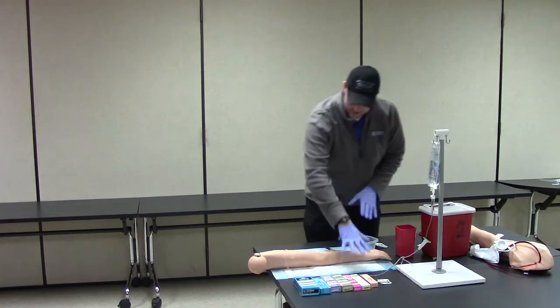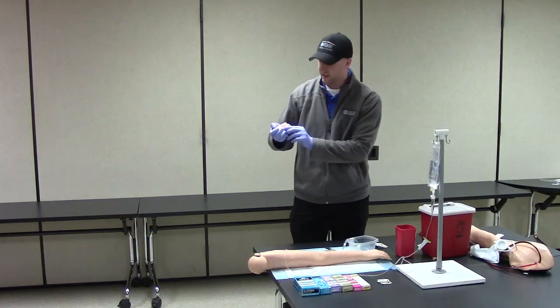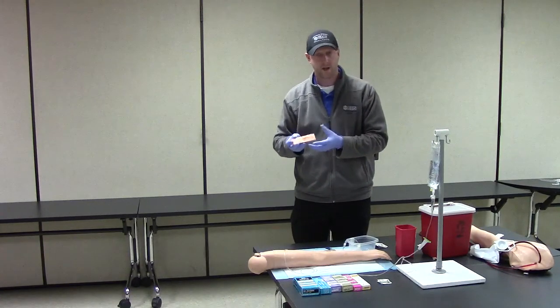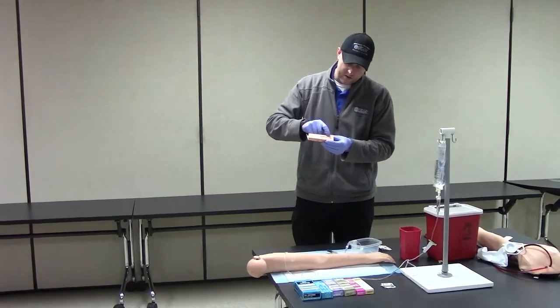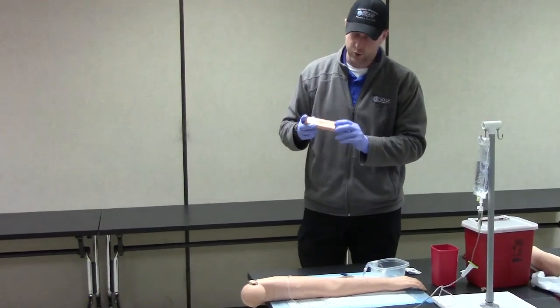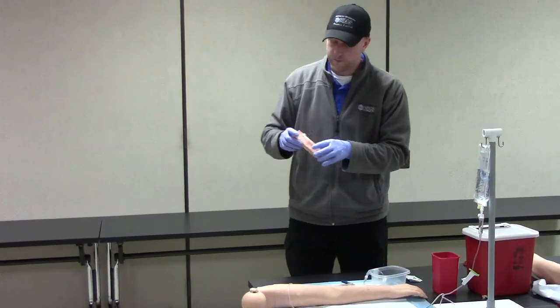Alright, from my pile of meds here, I'm going to select the appropriate one. Here I see that I have my Naloxone. Narcan and Naloxone are the same medication. I'm also looking at the concentration of the medication that I'm grabbing. This box says 2 milligrams per 2 milliliters, so it's a 1-to-1 ratio.